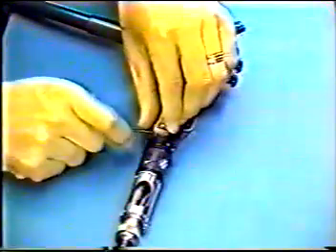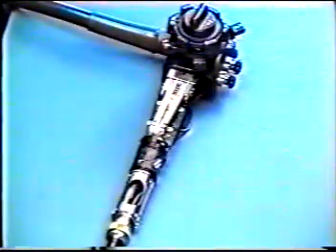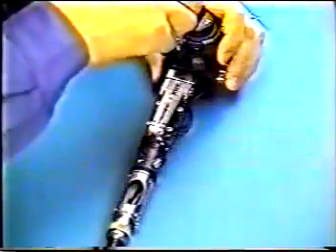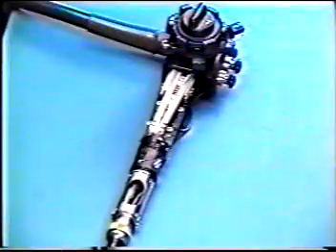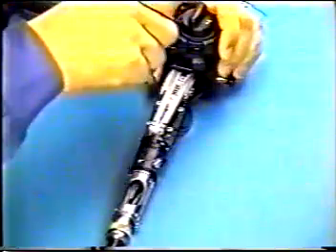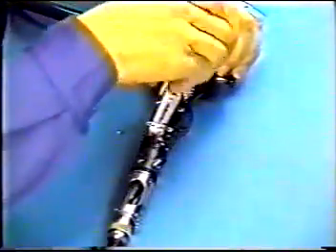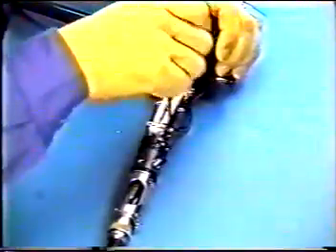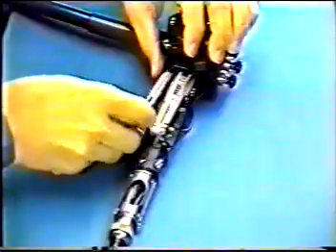Remove holding cover. Remove two holders. First, smaller one. Loosen the screw and remove bigger holder together with spacer. Remove 4 screws. And then remove stoppers for up and down and right and left angulation.